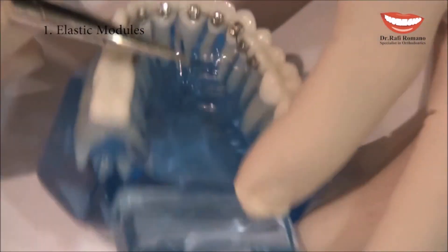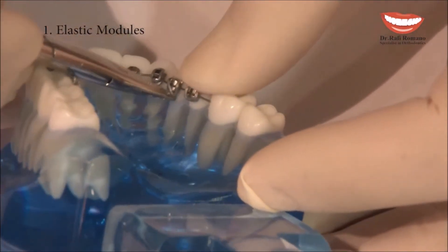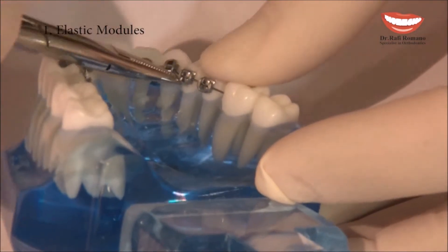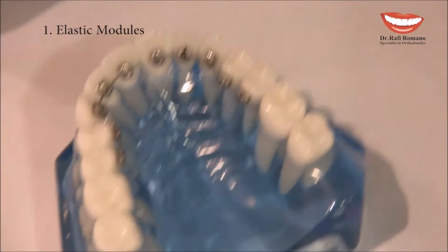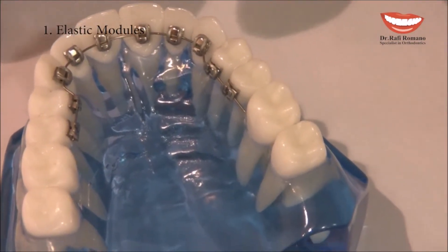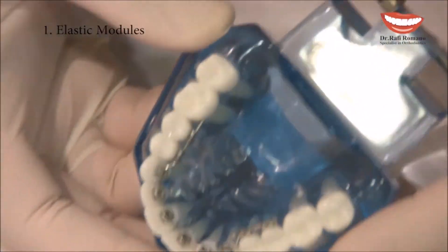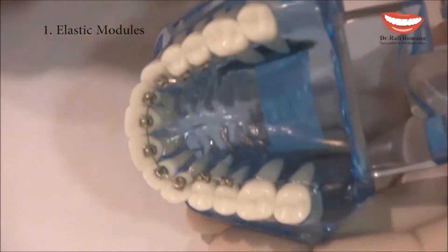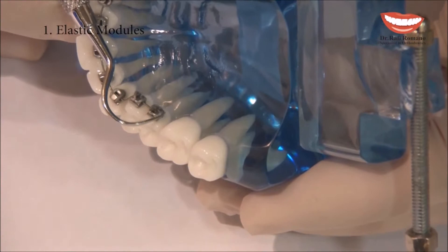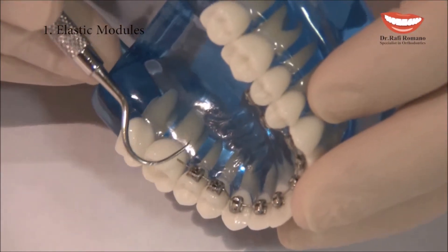Going back to the premolar, there are two wings — one mesial and one distal — so I can decide to tie on all four wings, or only on the mesial, or only on the distal. Once I have completed the ligation, you can see there is a small wire here and a bigger wire over here.